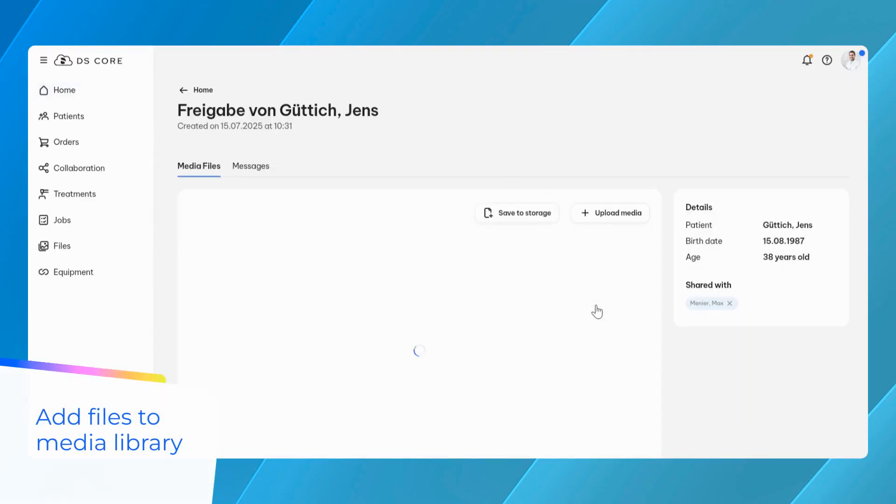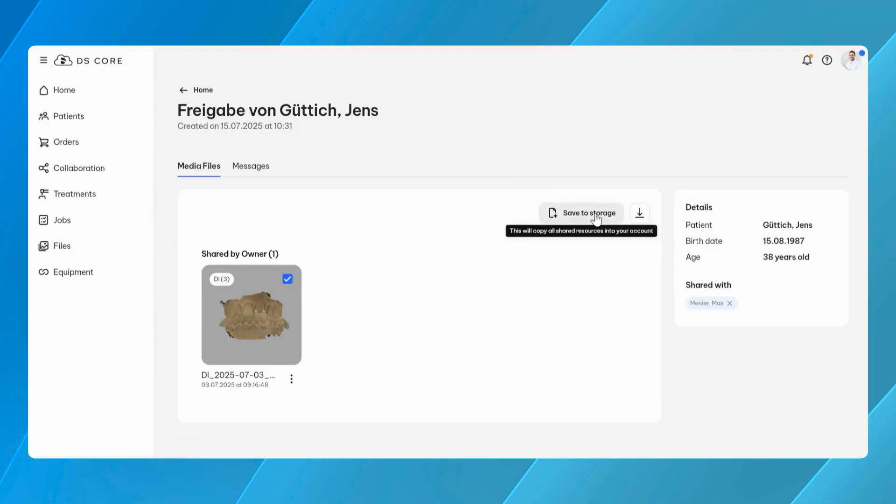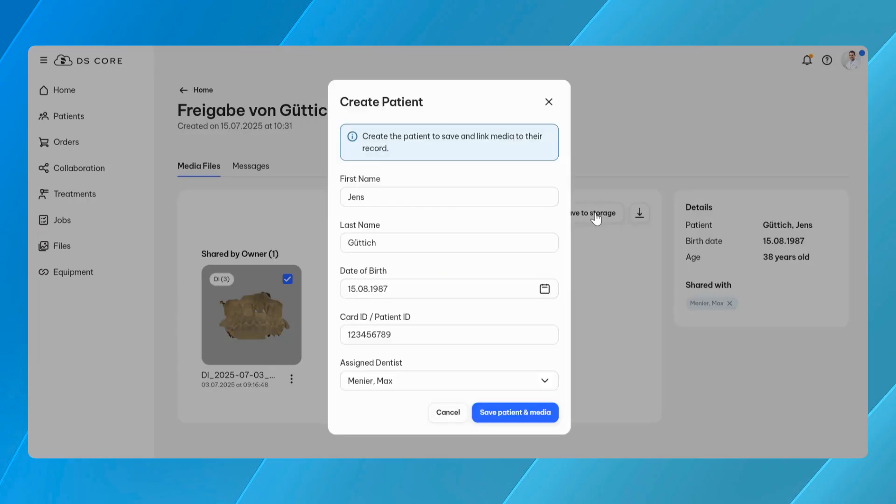DS-Core now allows the sender and the recipient to save patient data from a share directly into a patient in DS-Core. This helps maintain a complete and organized record across practices and simplifies referral workflows.